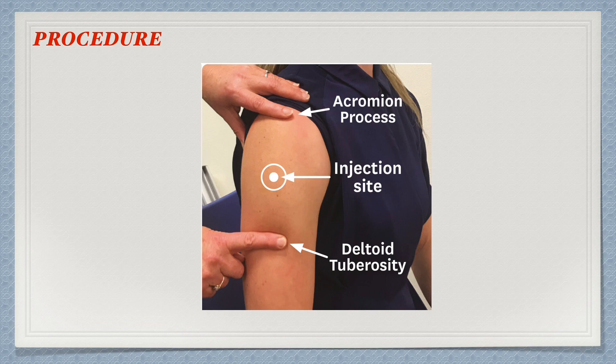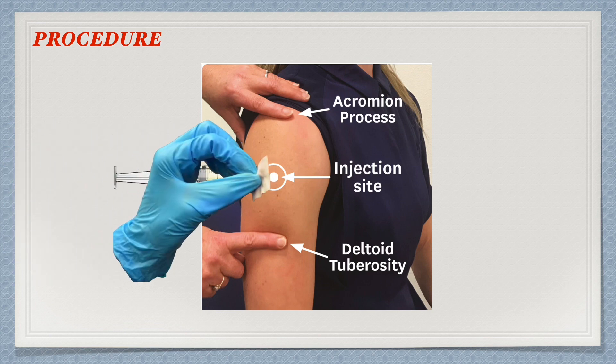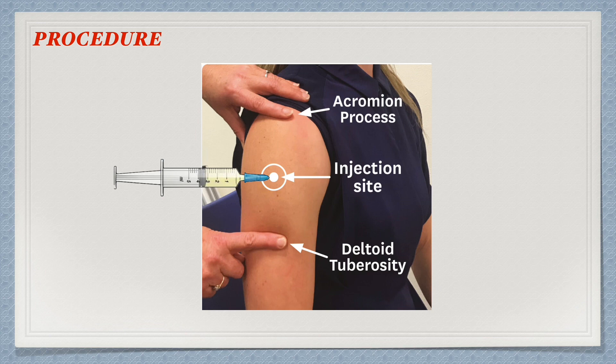Pierce the needle at a 90-degree angle. Before injecting the medication, aspirate the syringe to check if any blood is coming. If blood is coming, discard the medication and prepare new medication. Then inject the medication slowly. After injecting, withdraw the needle slowly while supporting the surrounding tissue. After withdrawing the needle, apply counter pressure over the injection site to prevent bleeding.